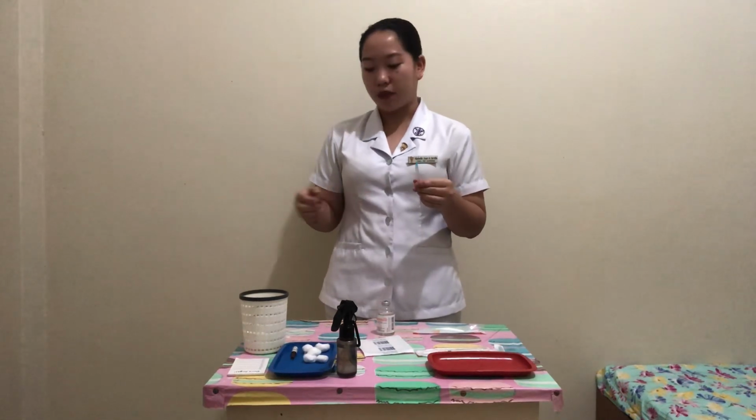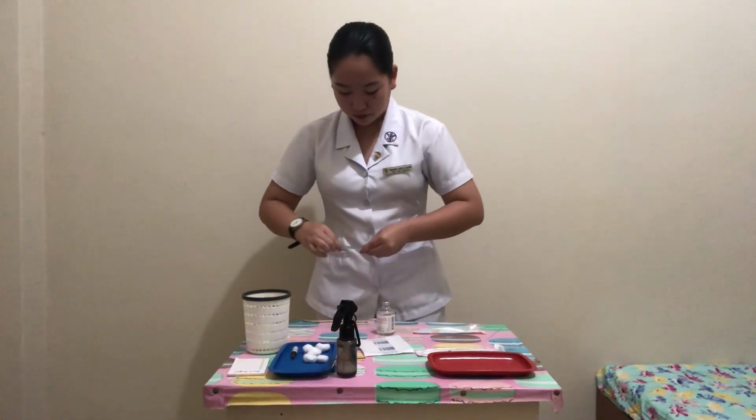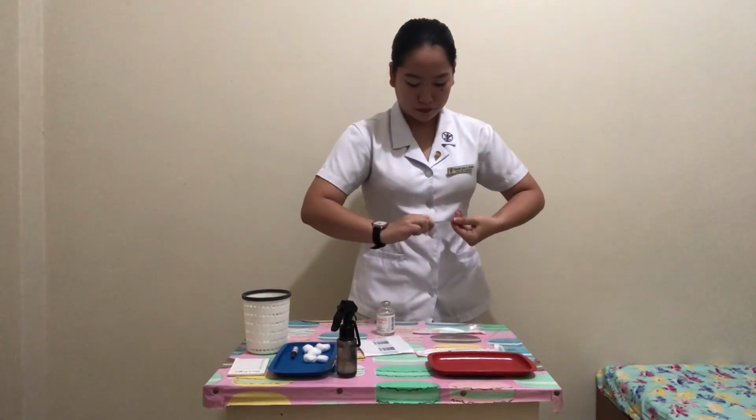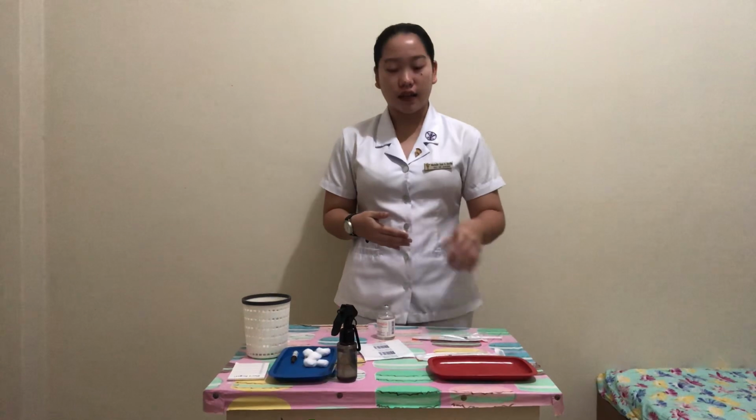So now we remove the aspirating needle and replace it with the right size needle that will be used in the actual administration of the medication. So we have already discarded the aspirating needle into the waste receptacle to avoid needle prick injury. And now write the medication ticket, name of the drug, and the dosage so that we won't forget what medication was drawn into the syringe and we won't get confused.